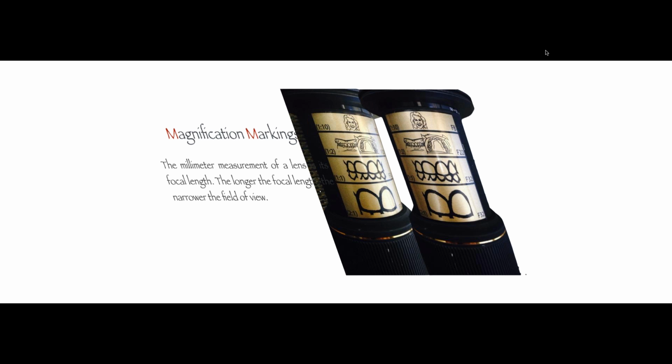Now, if you want a more macro photo, like let's say that you want to achieve only 4 teeth or 6 teeth, you go to the 1-to-1 ratio, 1-to-1 distance from the subject, and now you're going to use f32 as your f-stop. I'm going to explain to you what an f-stop is. But for now, I'm just giving you this information so that you can see that all these markings on the lens are going to make your work easier, because there's nothing to remember. Everything is going to be very, very simple. Now, the full macro 2-to-1 relationship, we're only going to get 2 teeth in this photo, and we're going to use the f-stop at 32 as well.